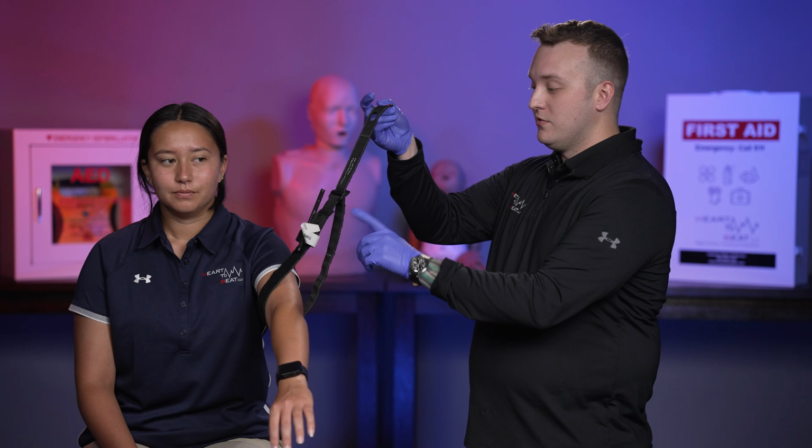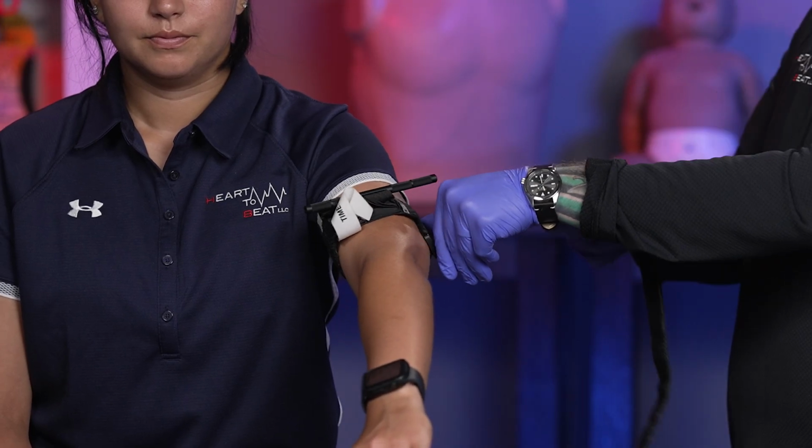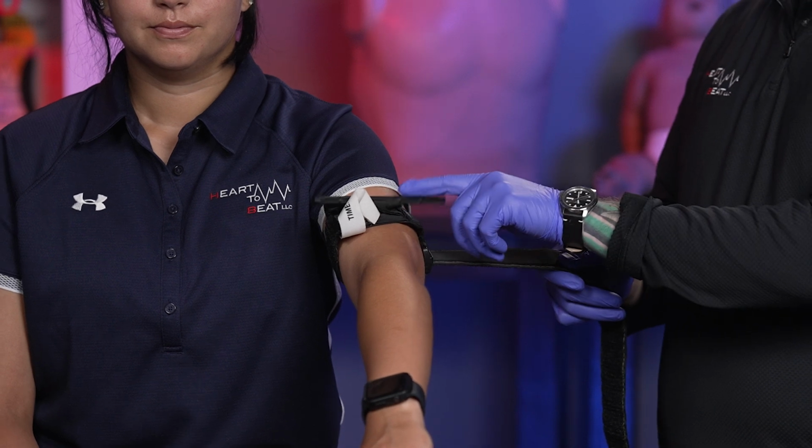Then we're going to use the Velcro through the buckle and tighten it down as much as possible. We really want to crank on this and get it as tight as possible before we go to the next step.